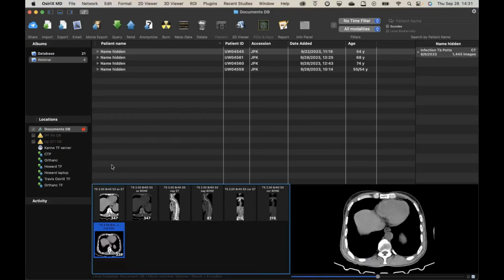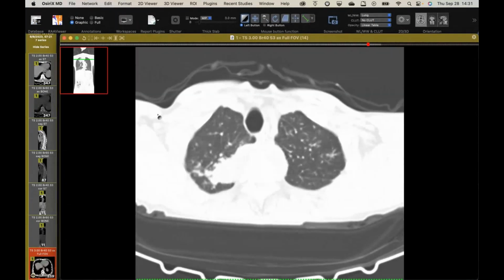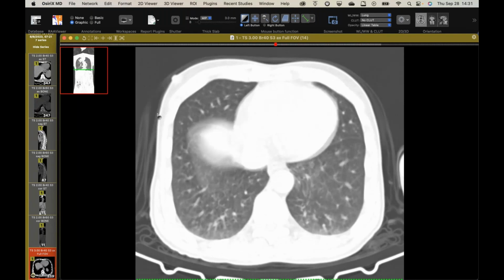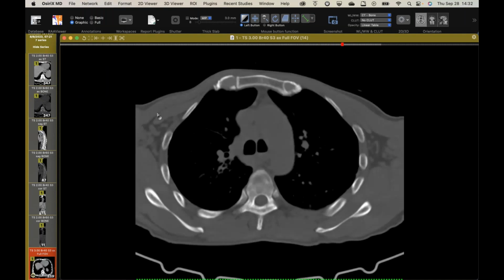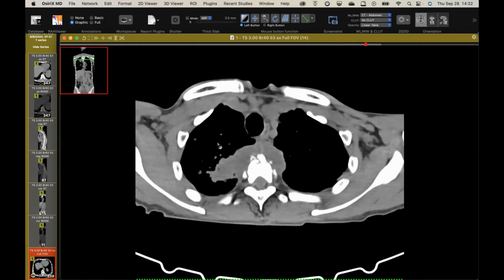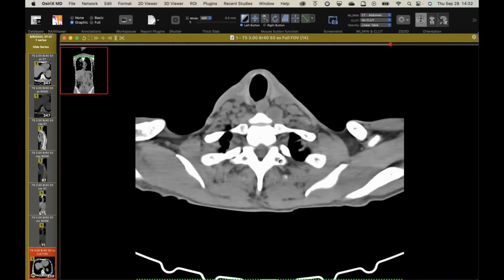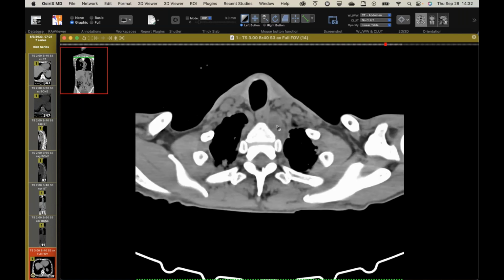This first case is a patient who has this mass, little cavitation, and all these tiny nodules. Can't hold their breath because they're quite short of breath, but you can see all these tiny nodules. Most are in the upper lobes. And then on the soft tissue windows, you'll see that this mass seems to extend towards the posterior, the paraspinal region, and there's this sort of low attenuation material tracking into this, even into the, I think this is longus coli here, but tracking into the paraspinal musculature along there.